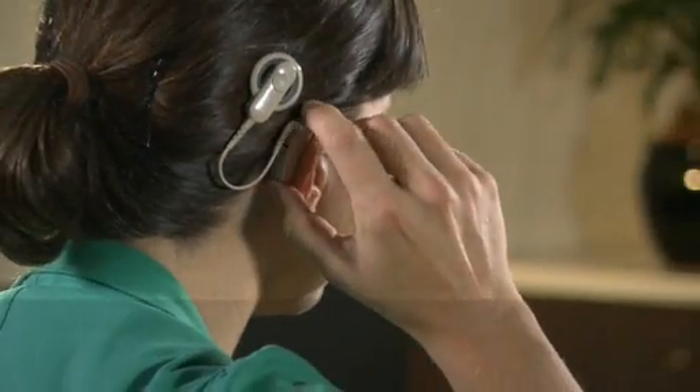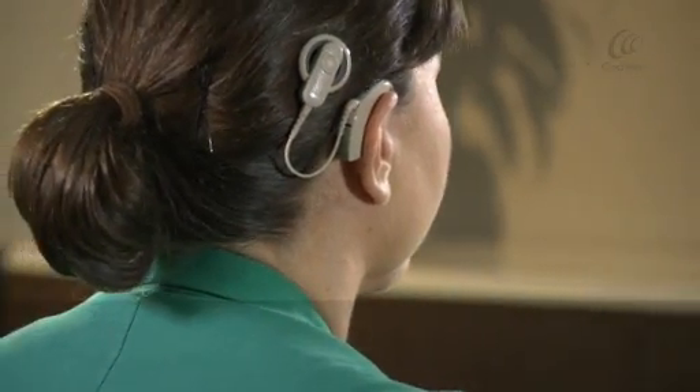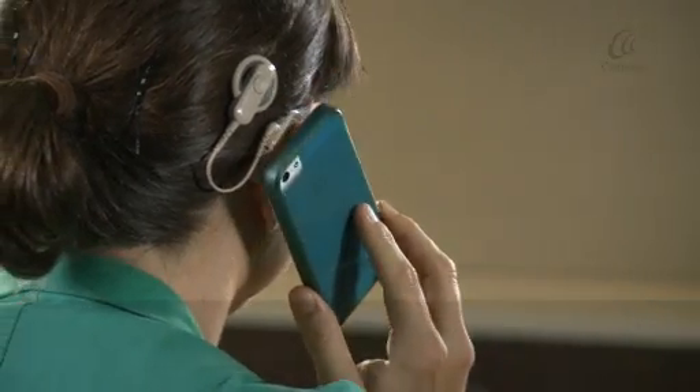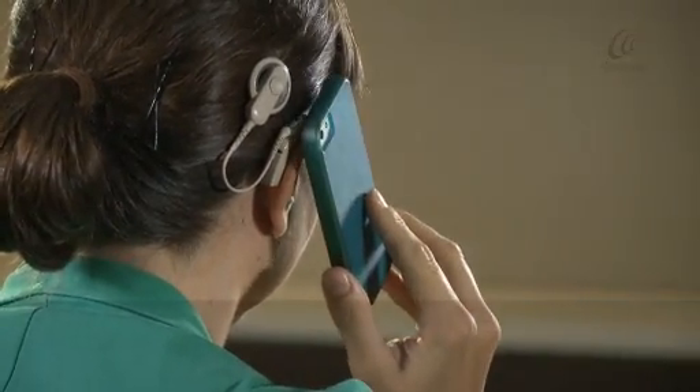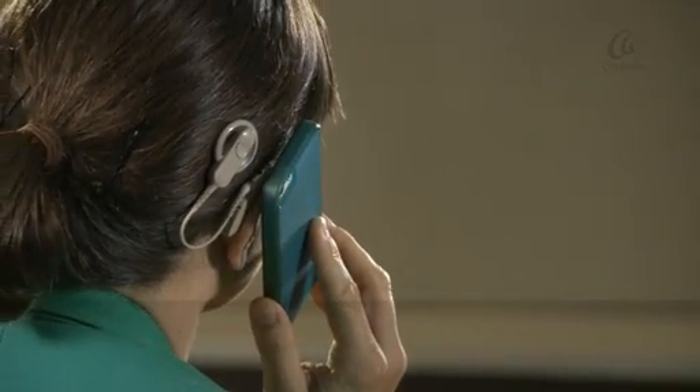Quickly press the upper button to turn manual telecoil on. Position your phone's speaker over the microphone portion of your sound processor. It may take a few moments to find the best position.